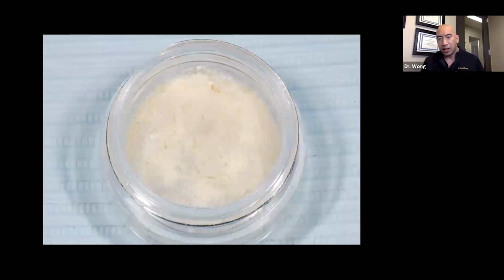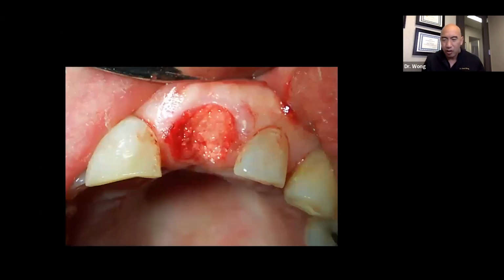You're going to do that, let it sit there for 15 to 20 minutes. That's ideal. If you go in too early, then it gets kind of dry. It's hard to work with. So make sure that you hydrate it for the recommended time of 15 to 20 minutes.